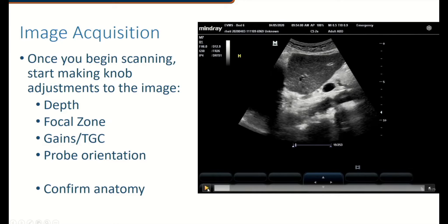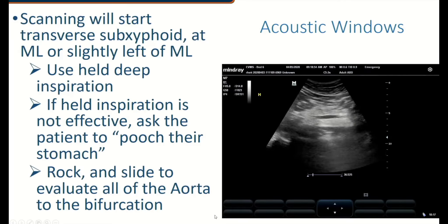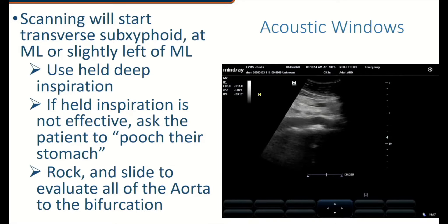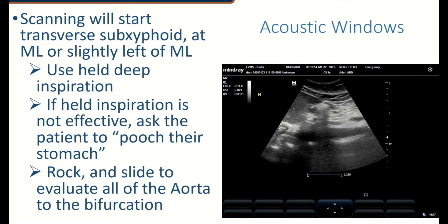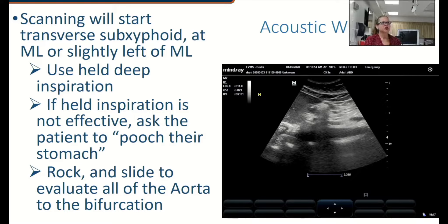We're talking about acoustic windows here. All of this scanning was done at a sub-xiphoid abdominal window, beginning very sub-xiphoid, quite superiorly, just left of midline. Typically you're going to use either a deep held inspiration or a pooch of the belly from your patient. As you look at the aorta, you're going to rock and slide and look, and I'd like to go to scanning now to show you what we're going to do.